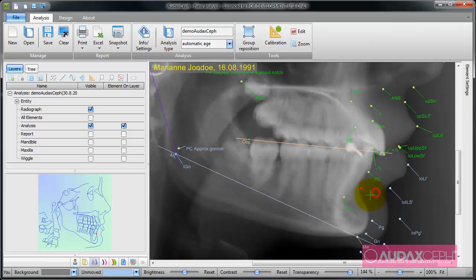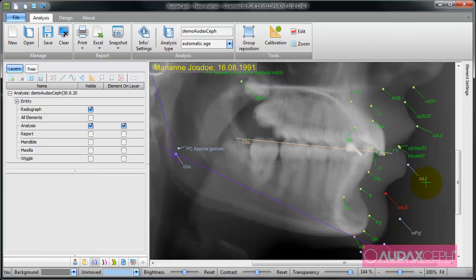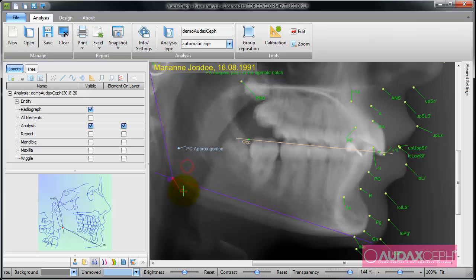The order in which I move points is not important. You can also note that I have a help image, and with this help image I know exactly which point I am moving.